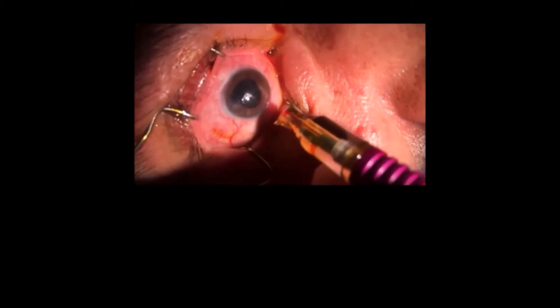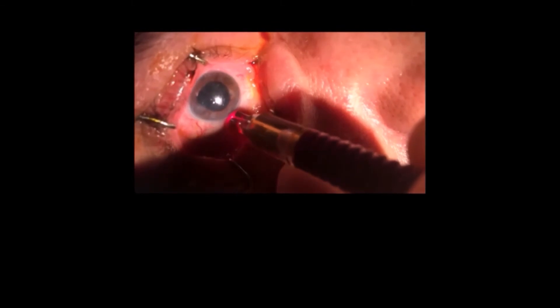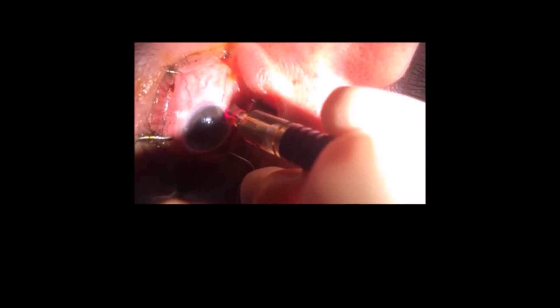Dear colleagues, this is a procedure for glaucoma cases that have IOP uncontrolled under medication and sometimes post-surgery also. This is a photocoagulation of ciliary body from the outside. It's a probe from Iridex and it's a very good and safe procedure. This case here has an IOP before the procedure of around 45 mmHg.